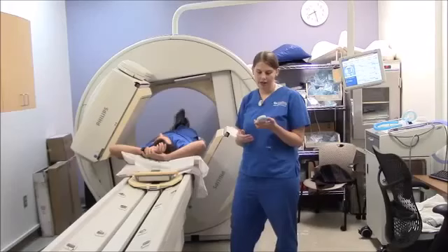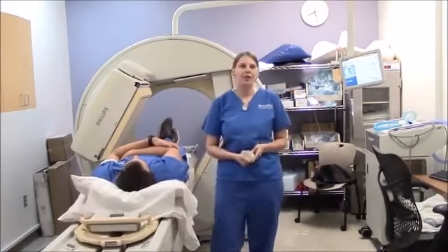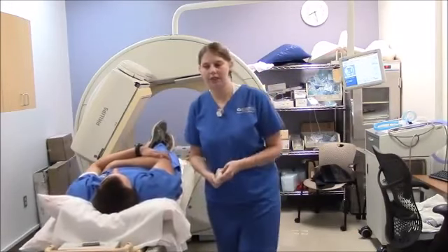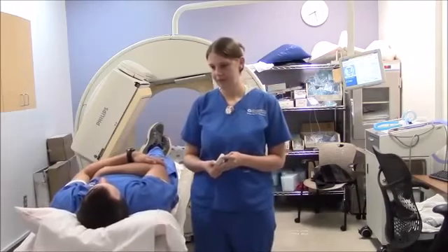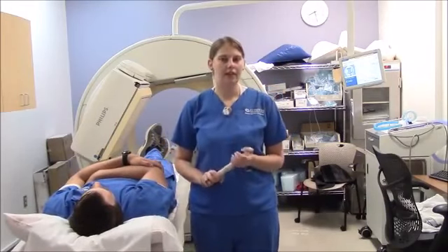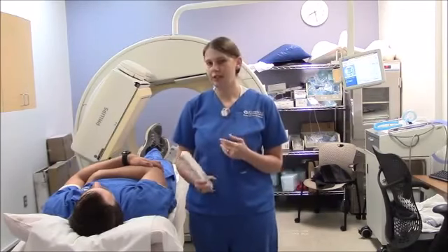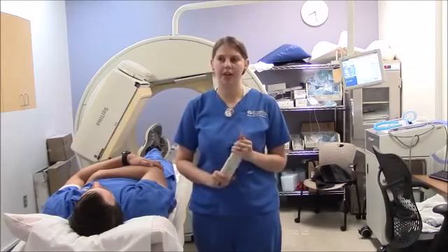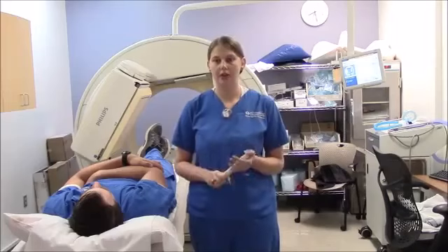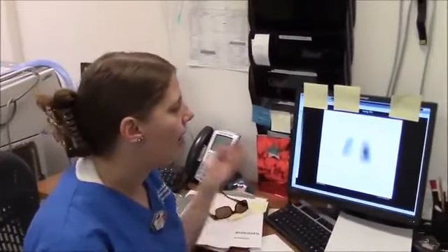So now I'll pull my patient out. Let them relax their arms as soon as they can. They're often sore from holding them up that long. Now before you let the patient go, it's important that you get your study read by a radiologist first. If this patient does turn out to have a pulmonary embolism, that's not somebody that we want to let go without treating first.